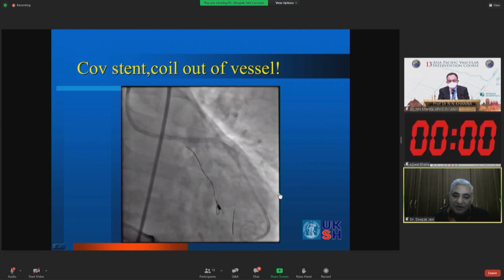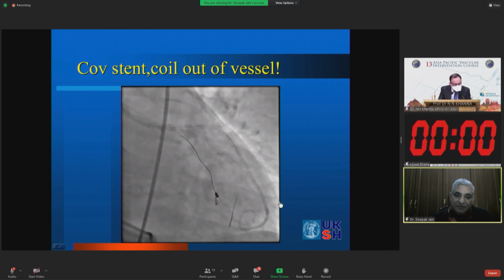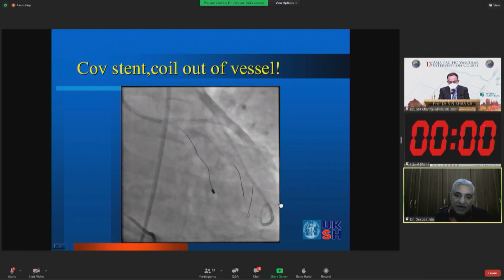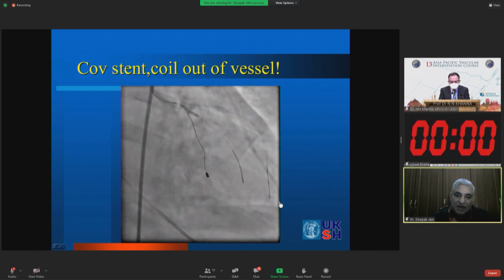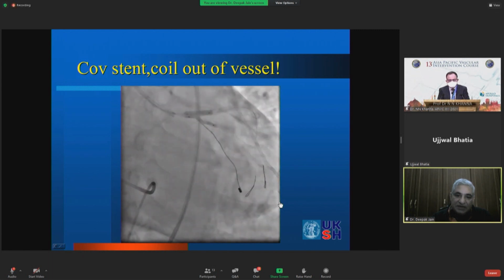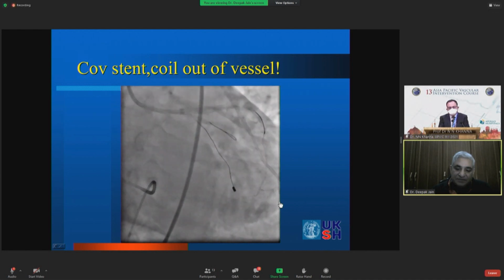Pericardiocentesis, you can see the catheter lying in the pericardial space. Left main became unstable, so left main dilatation there, stenting, and then we realized the problem. So we thought we should exclude this artery by putting in a covered stent from the Lcx ostium to the marginal artery. That's what we did. This is a covered stent in the marginal artery. We excluded the Lcx and did a kissing technique, and finally we could salvage the case.